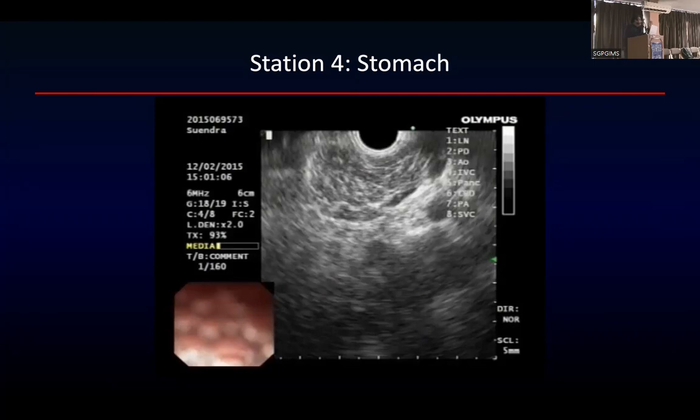It is smooth, right? You can see the coarseness here, looking at this you can see it is coarse, so by looking at it you can say something is wrong with the pancreas. So here you have many features: hyperechoic foci, hyperechoic strands, lobules, presence of calcification. These are the features which tell you that the pancreas is abnormal. If you have more than 4 features, it tells you that the patient has underlying chronic pancreatitis.